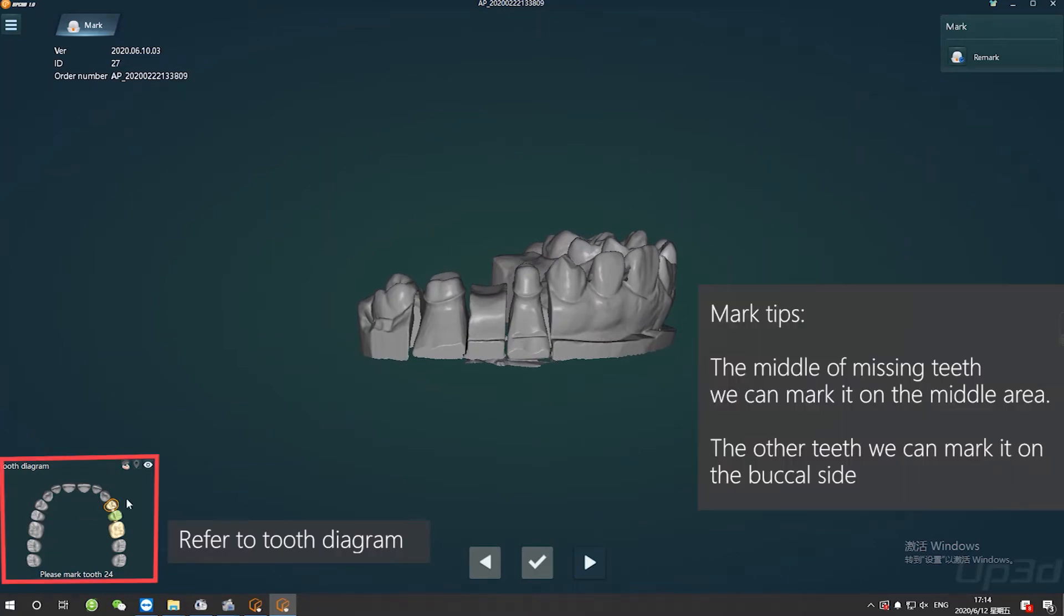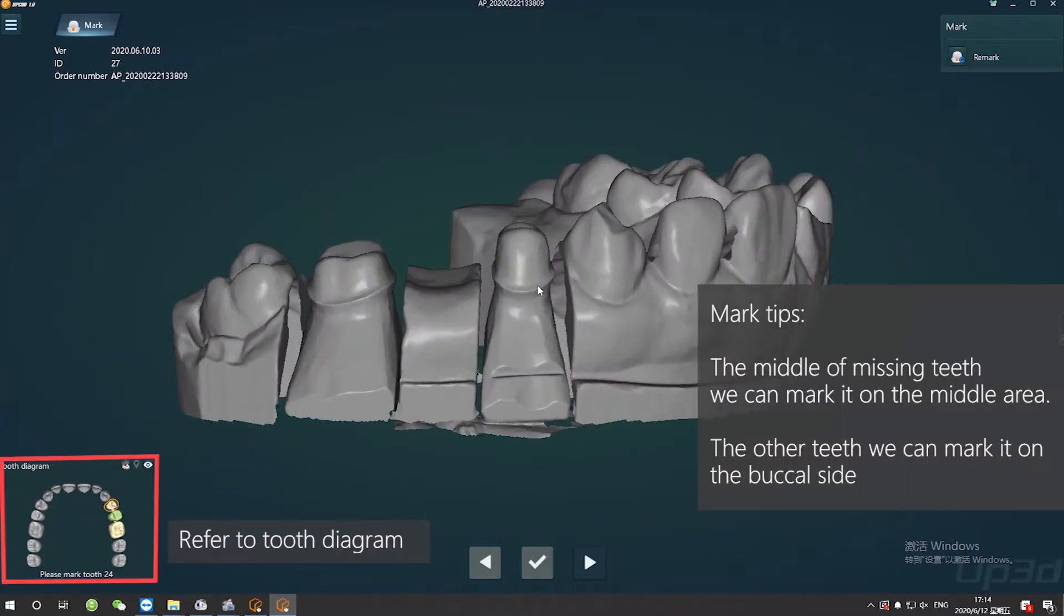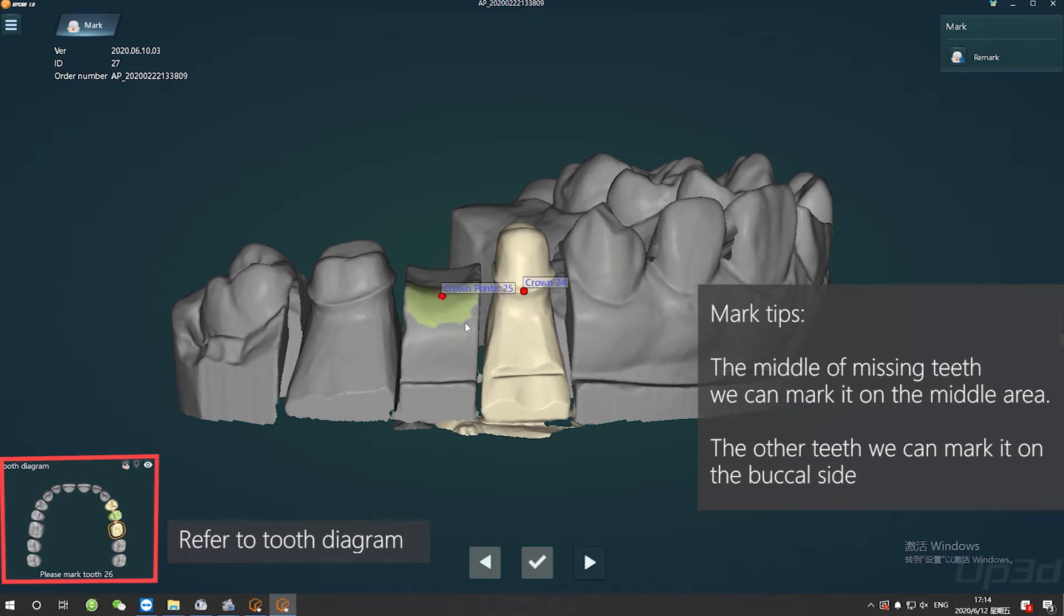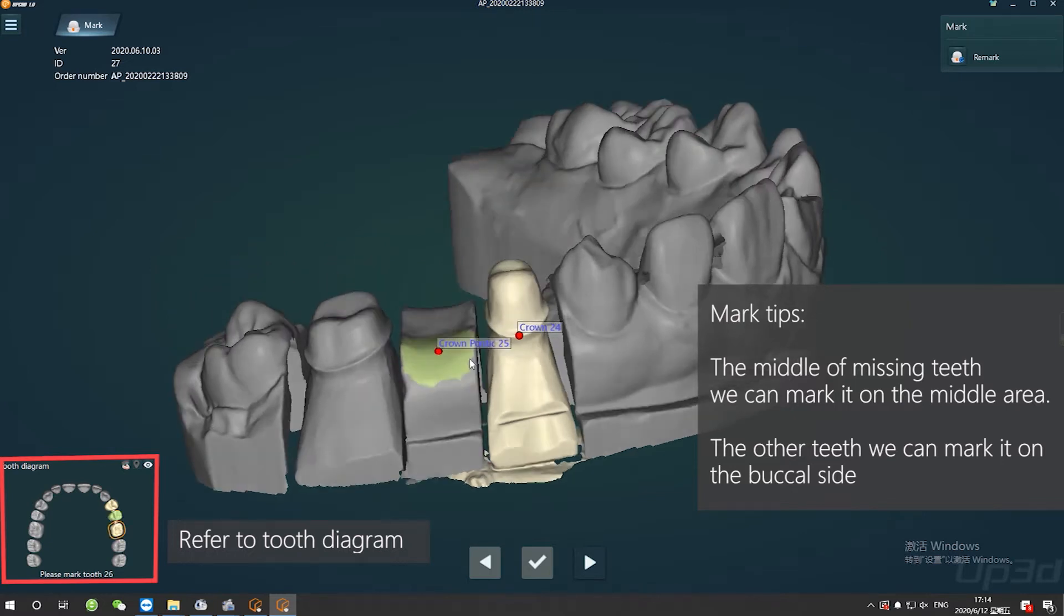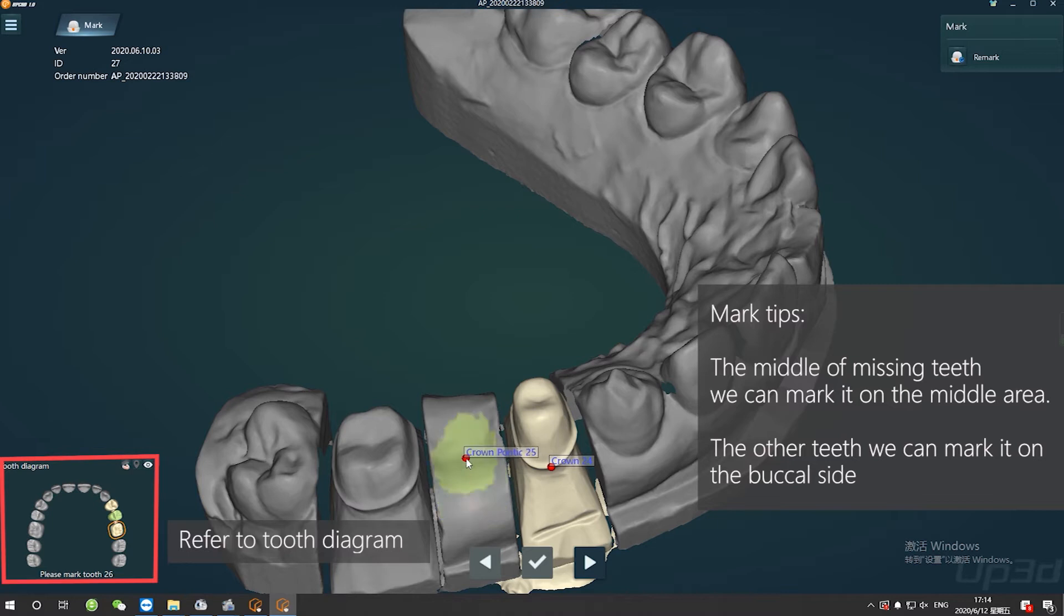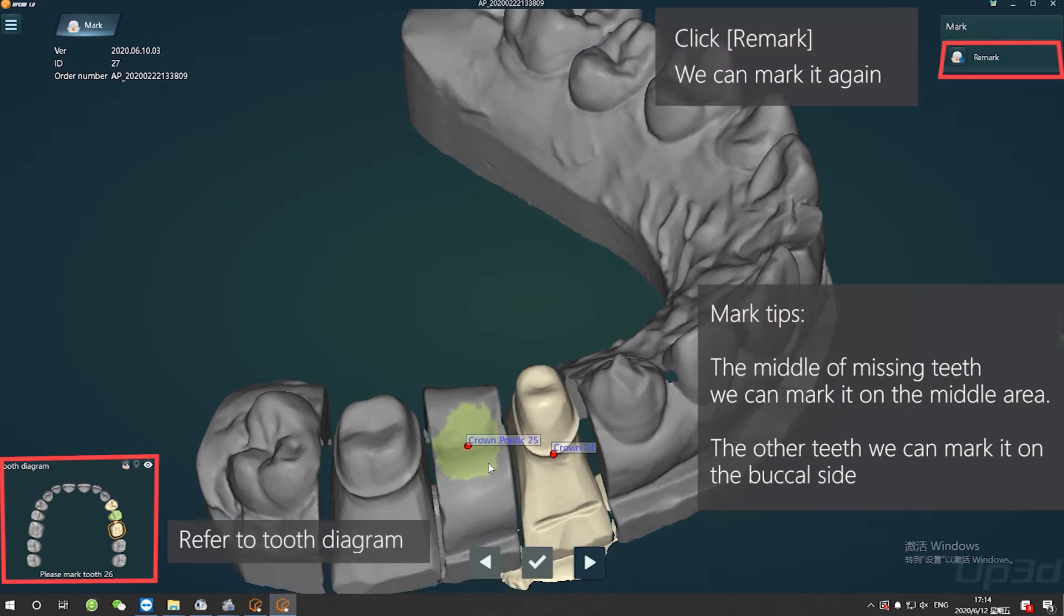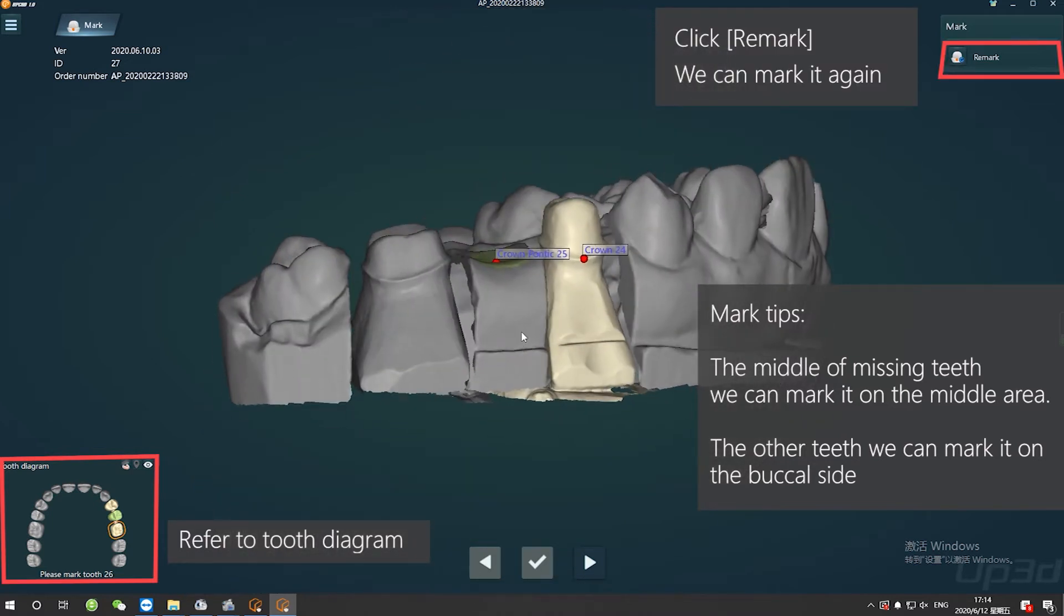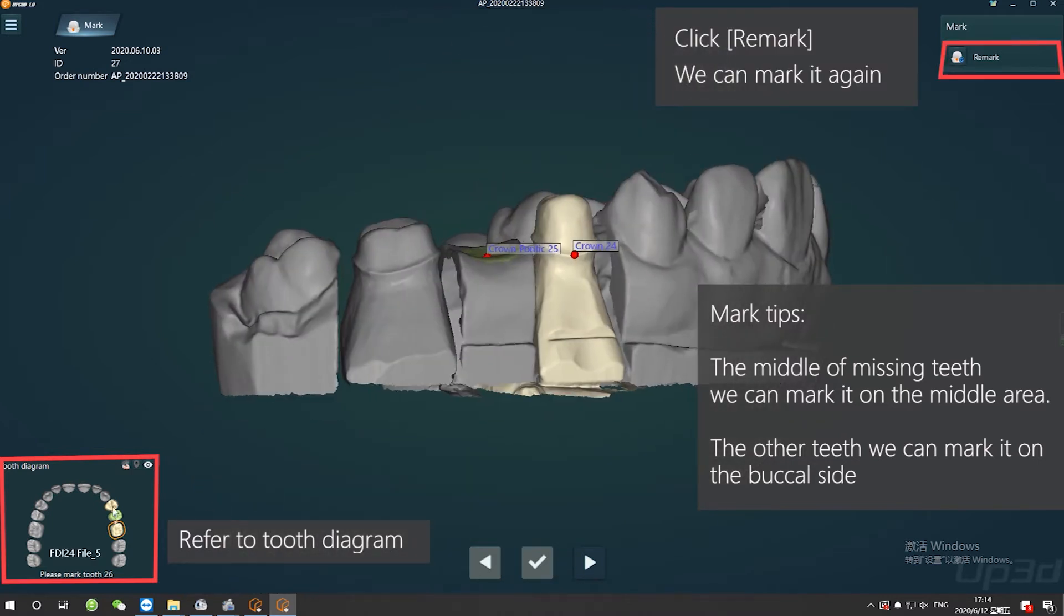Refer to the left window to choose tooth number and click its buccal margin. If you make a wrong mark, please look at Remark. Click Remark button, you can mark it again.